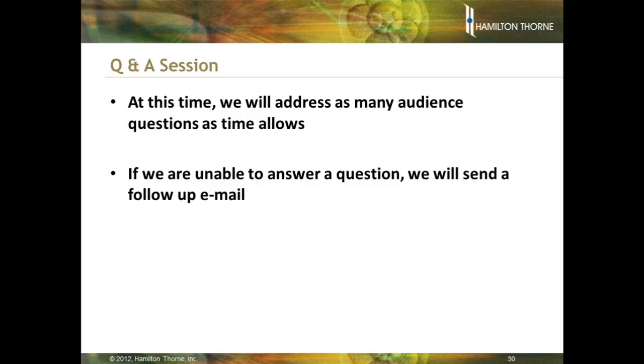I think spewing numbers is not that helpful, because there are a variety of variables that contribute to success rates, but I can tell you that my best success rate with PGD, or PGS I should say, PGD is not that easy. We don't have as many options, if you will, to do this fresh on day 5, day 6, but it certainly can be done. With PGS, the best results I've had per cycle initiated, which is really what patients care about, is doing a biopsy on day 5 and a transfer on day 6 and freezing anything that's normal on day 6.